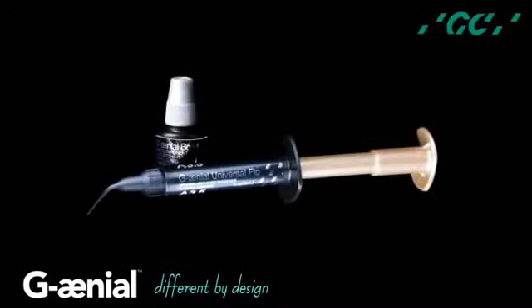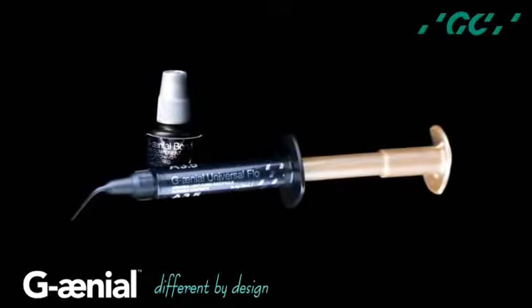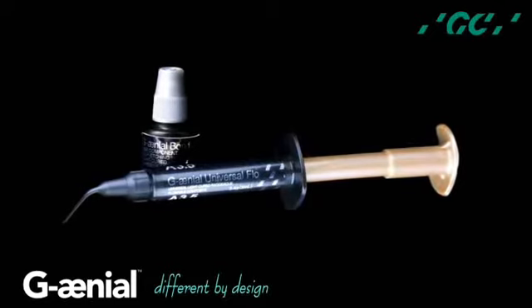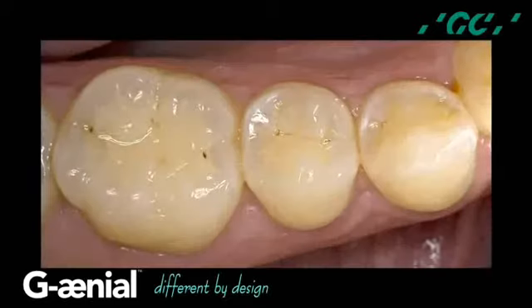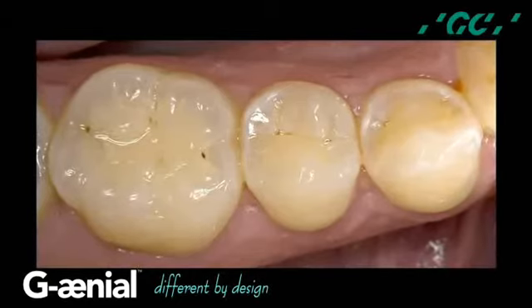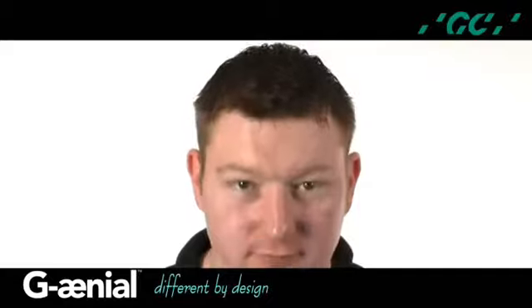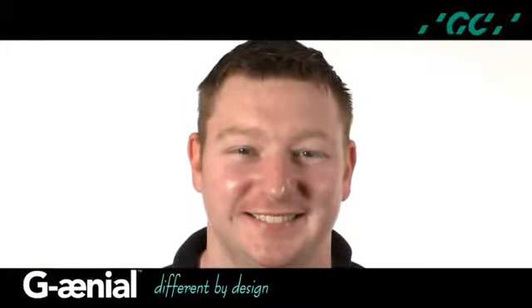Although not a panacea to all restorative challenges, the utilization of this nanoparticle hybrid flowable composite, G-aenial universal flow, in this 3-month review demonstrates enhanced sculptability, the polishability of a microfill, the strength of a hybrid, and the ability to simulate the optical properties of the natural tooth.